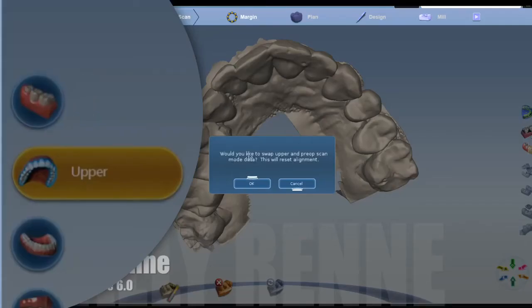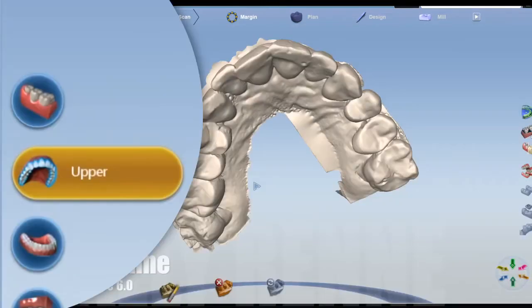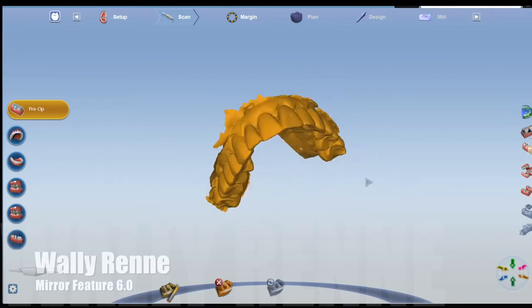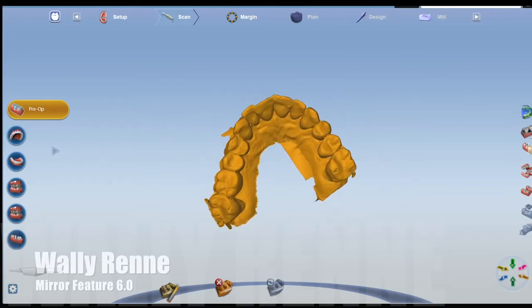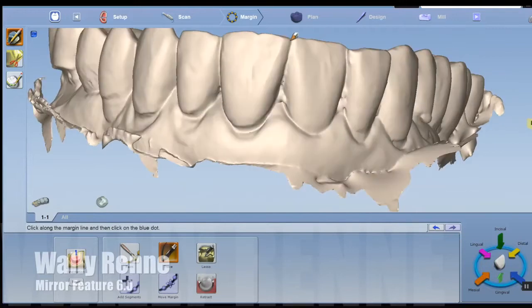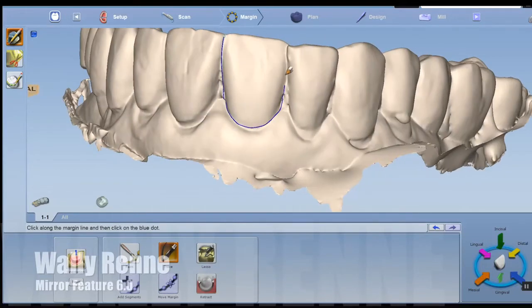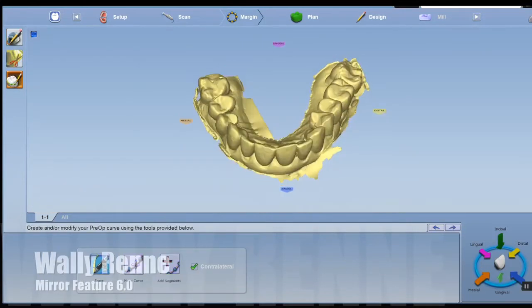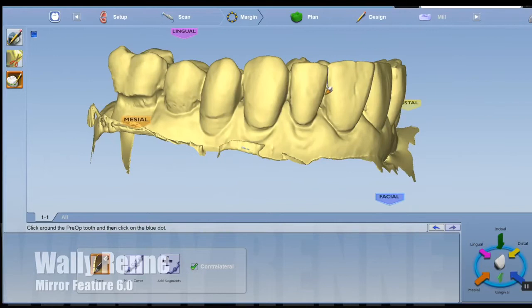What I'm doing is showing you a new feature where I'm able to take a scan and move it to a different library. In this instance, I'm taking the upper scan and dragging it into the pre-op. So now it's copied over into the pre-op as well. What I'm going to do is a wax-up for this patient who's thinking about getting veneers on 8 and 9, or at least maybe even number 8.